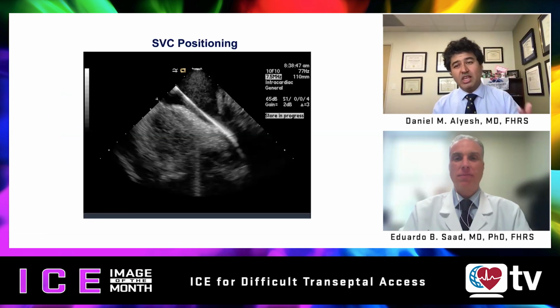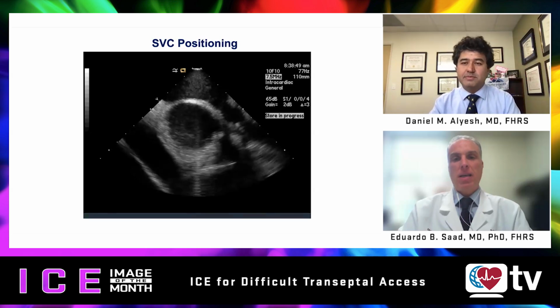Eduardo, thank you so much for these wonderful images. I'll have you start off talking about SVC positioning. We've got the ICE catheter here in the right atrium with posterior flexion. We're visualizing the SVC, and I'll let you tell us about what we're looking at.